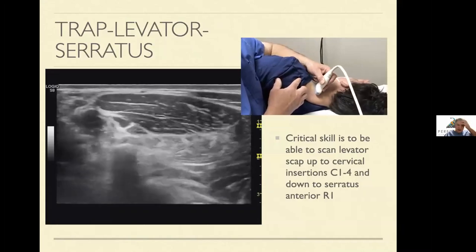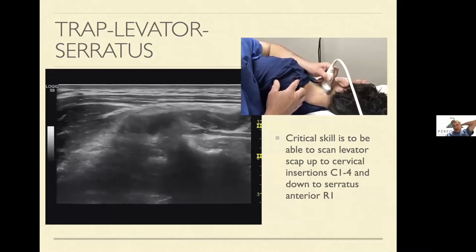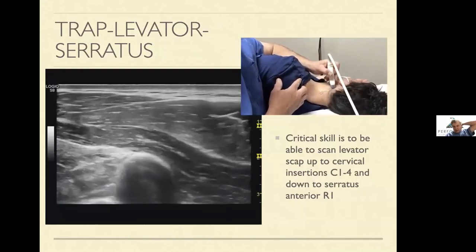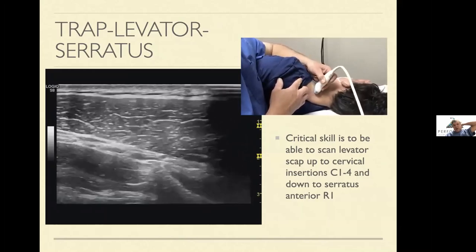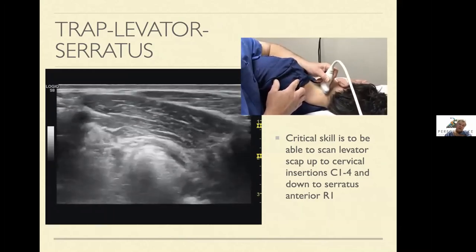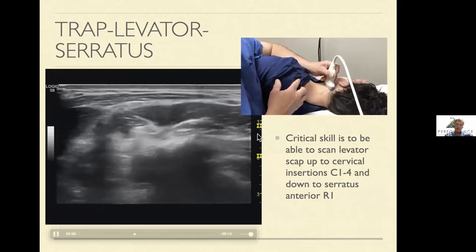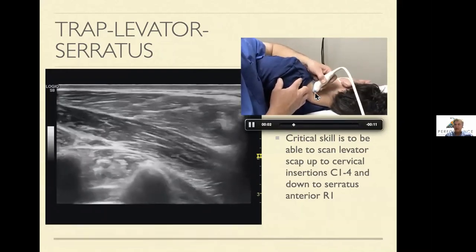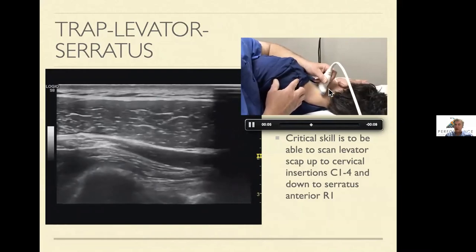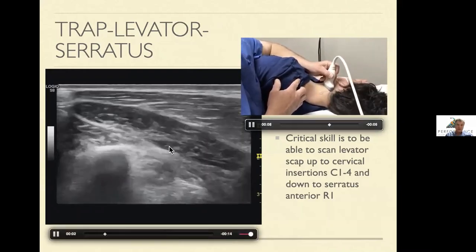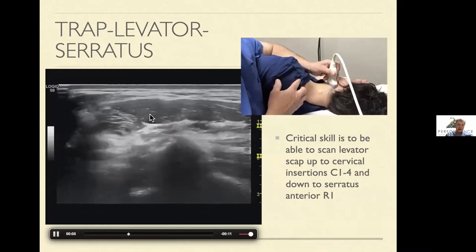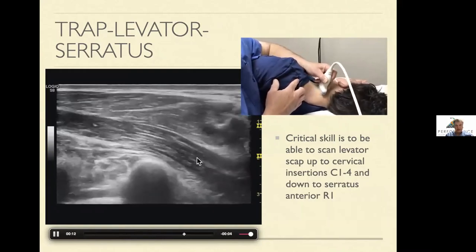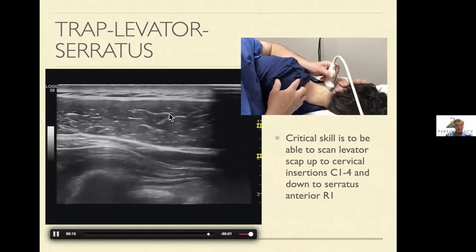The challenge in scapular dyskinesis is the levator scap and the trap. When you're first learning the scapular evaluation, you need a good understanding of levator scap. Here I'm scanning up and down the neck, following from the mid-shoulder portion all the way up into the distal. Here's levator, this is trap. I'm scanning up looking at these distant insertions — this is good to practice, going back and forth, watching levator scap slide in under here and trap come over the top as you go up and down the neck.